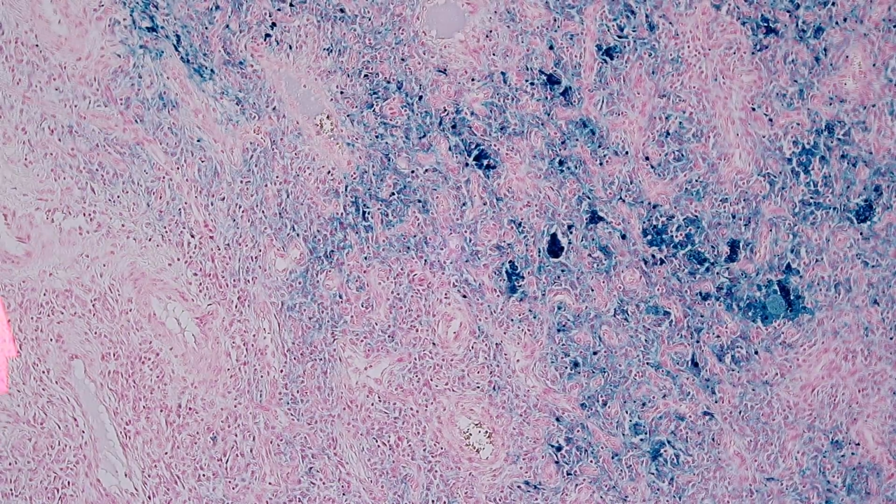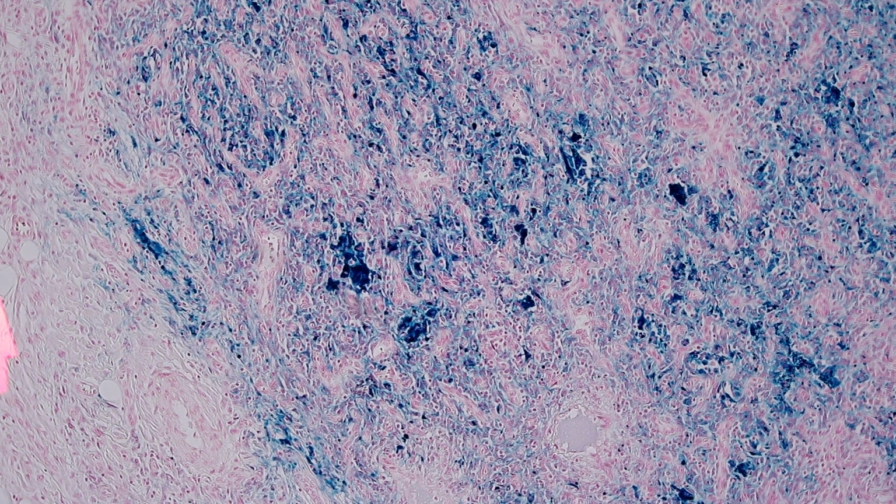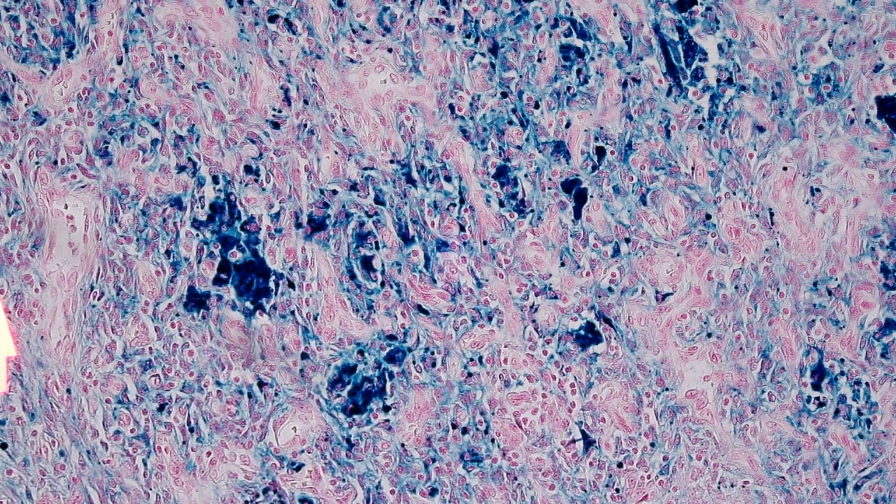And in this case, there are a few immunostains and special stains that highlight some nice features. The first one, even though you don't need it, this is clearly hemosiderin based on the H&E morphology, but if you really wanted to prove it, and prove that it wasn't melanin, say, you could do this, and this is a Prussian blue iron stain, which is beautifully highlighting the extensive hemosiderin here in this bright blue color. So a nice example, this is better than the control tissue, basically, to have this much hemosiderin. And you can see from low power the hemosiderin is everywhere, even more abundant than it looked on the H&E. The tumor is laden with it.